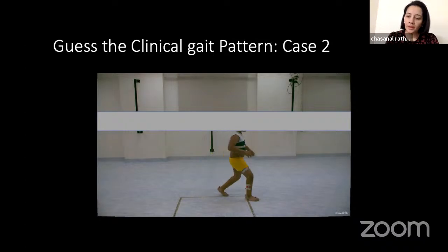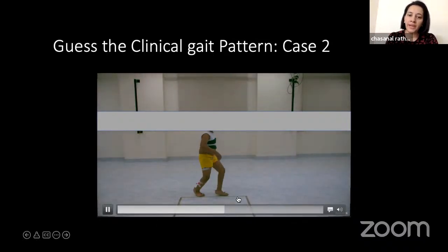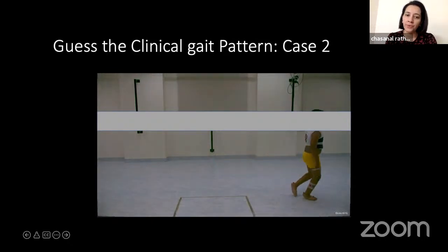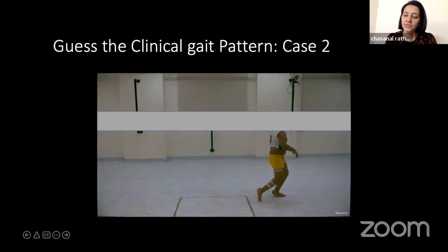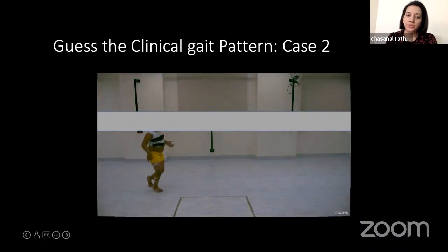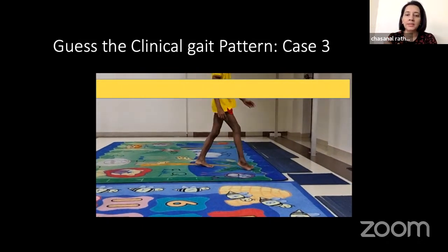Yeah. So it is a jump gait, and with the weight, the child has now slightly progressed with a mid-foot break, and he will progress towards a crouch now. So jump gait remains for a short while in very thin-built kids.